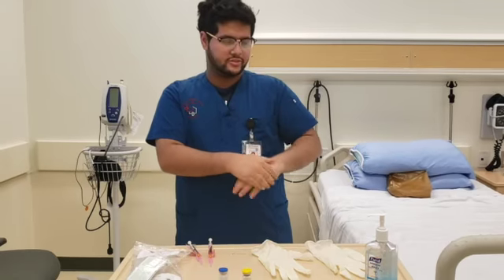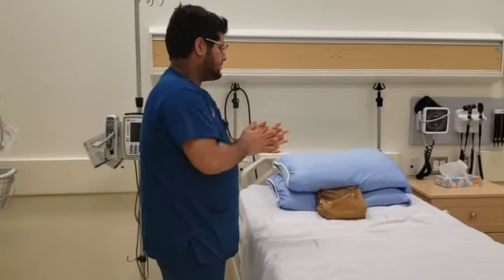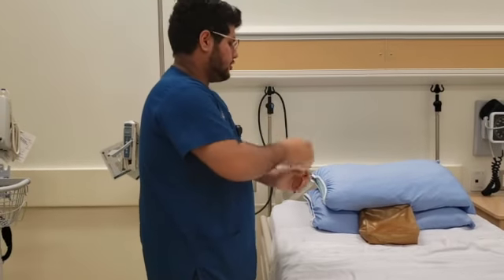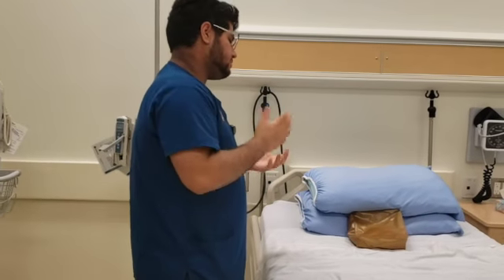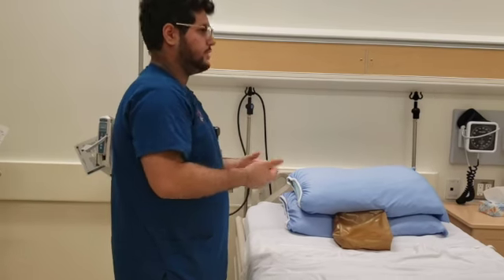sure there's no lesions and the skin is healthy. So Mr. Mancini, I'm just gonna be giving you the medication the doctors ordered. And there's two. One is intramuscular, which means that it'll be at your deltoid muscle. We want to give it at the deltoid muscle because it has a rich supply of blood, and the medication will go around pretty quick.